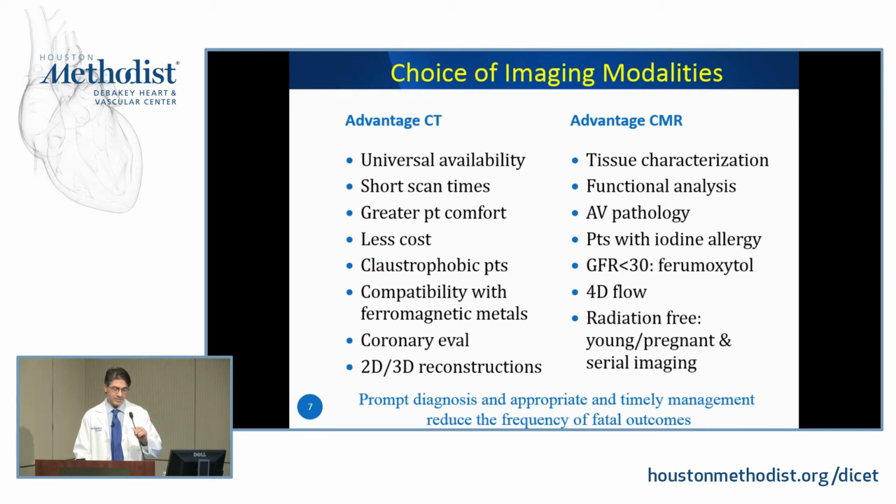Now, when it comes to CT and CMR, both of them are excellent anatomical tests. A lot of my talk will be spent showing probably 3/4 CT images, 1/4 CMR images, not because CMR is at all inferior in imaging. It's just that's what I could quickly acquire. But, to be honest with you, the images by CMR look exactly the same as CT. So consider them equal. So how should you choose who should get which test? We'll be going a lot into that.